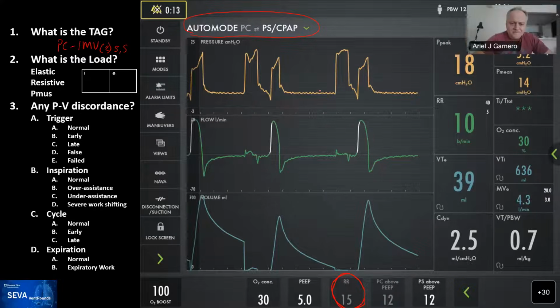Yes. This patient was about to be heavily sedated, so I tried different modes, but I was concerned about safety, so I tried auto mode first to be sure that there is some safety backup. The problem with auto mode, and we are describing this in the white paper in the next paper that's going to be published in Respiratory Care, is that the apnea time after 1 or 2 breaths is not the apnea time we saw on the vent, it's much shorter.